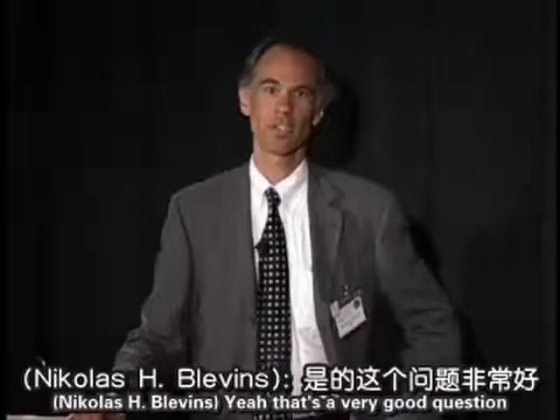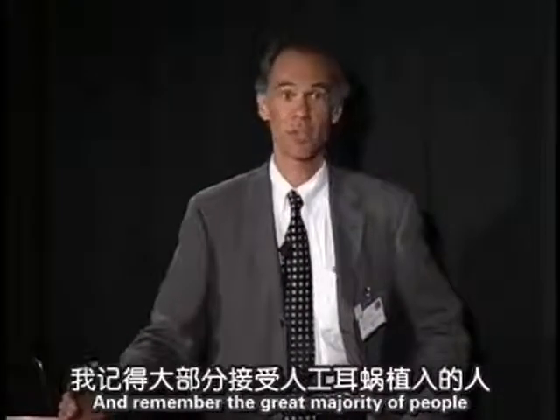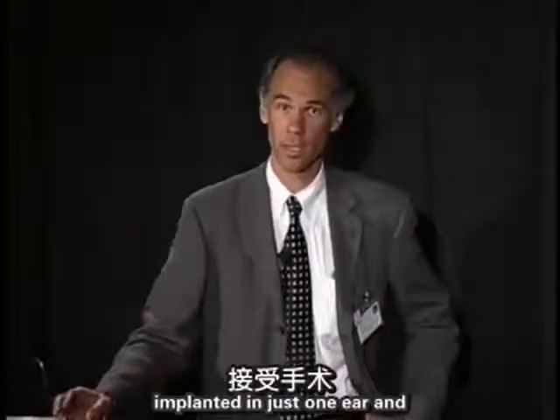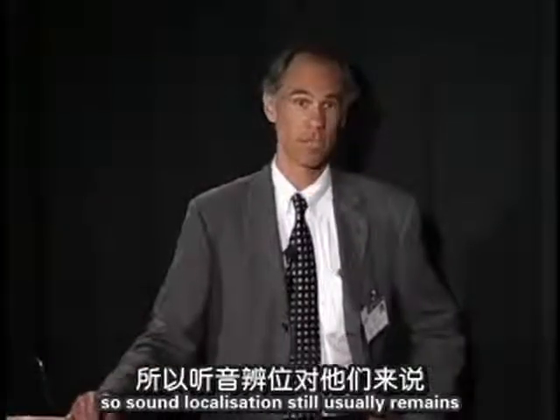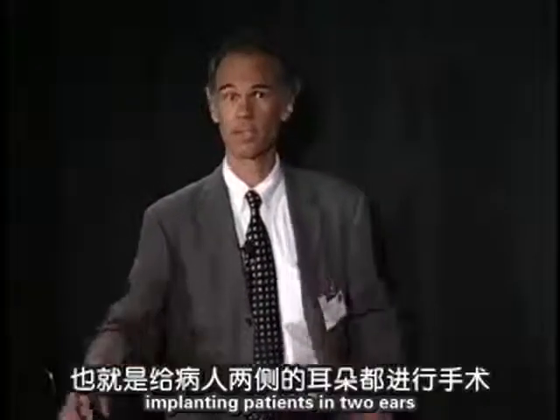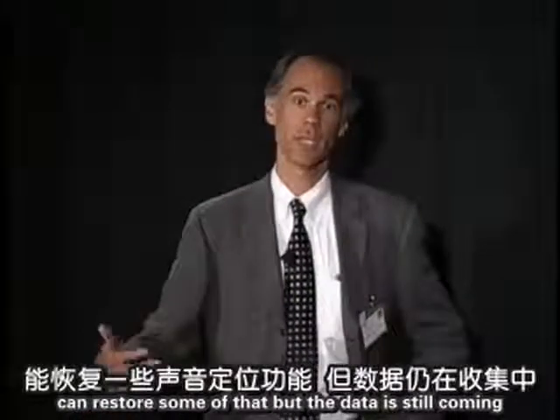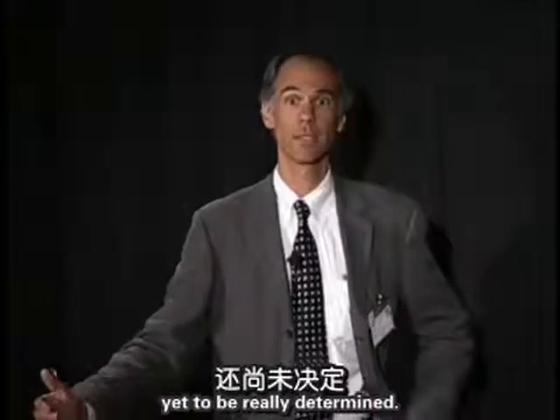Yeah, it's a very good question. It's how well do people localize sound with this? And remember, the great majority of people who are getting cochlear implants are still being implanted in just one ear. And so sound localization still usually remains quite a challenge for them. There is some evidence that bilateral implantation, implanting patients in two ears, can restore some of that. But the data is still coming in, and the real-world effect of that is yet to be really determined.